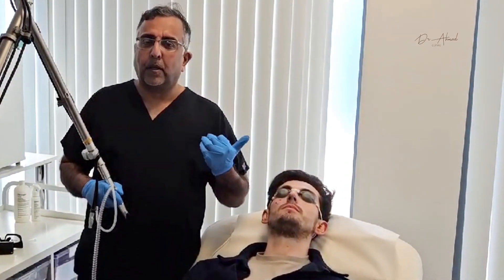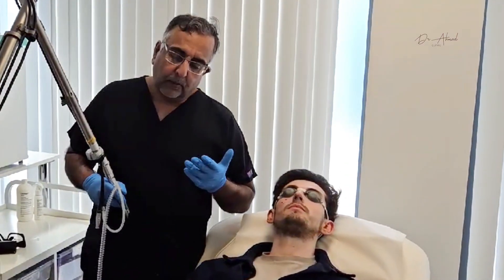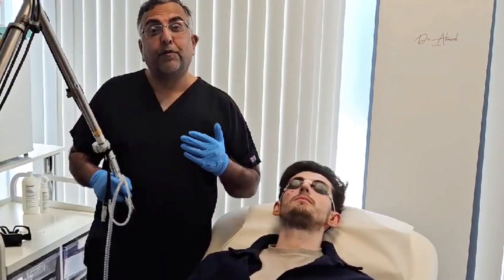Hi guys, it's Dr. Tukir Ahmed from our clinic here in Glasgow, and today I have with me a patient who's in for mole removal but did not want to have any scarring and surgical scars from actual excision of the mole.